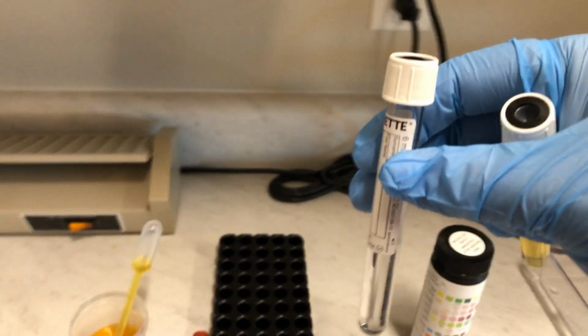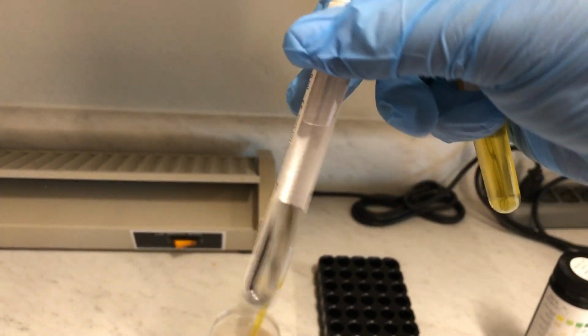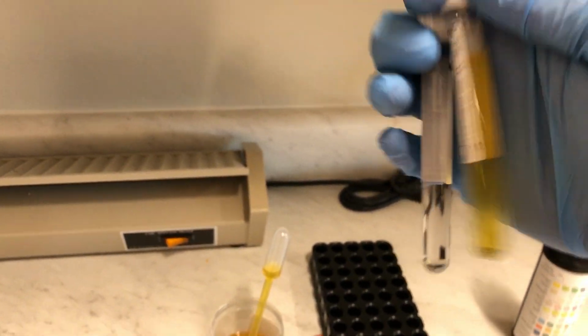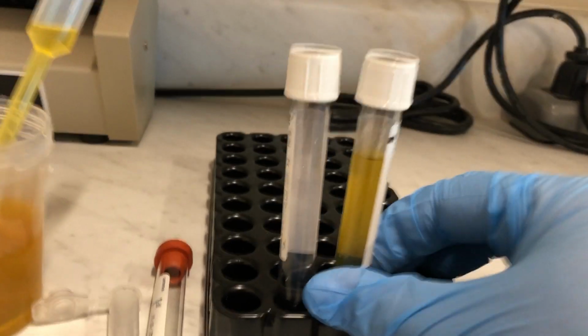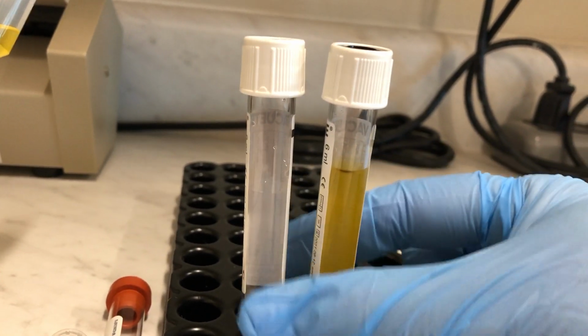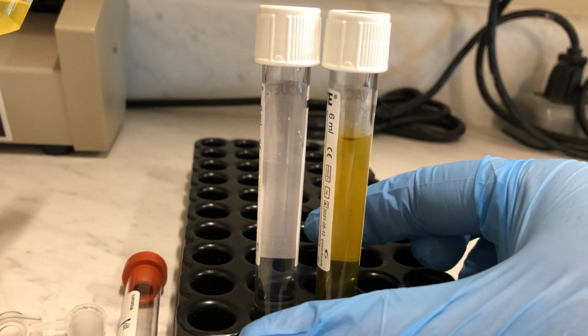And then the other thing you need for the centrifuge is a balance tube. So you need an identical tube to the one that the sample is in, and it needs to be filled approximately the same amount. So if we compare these two, we can see that the balance tube is just a little bit short on water, but we're not going to spin it at a very fast speed, so this should actually be fine.